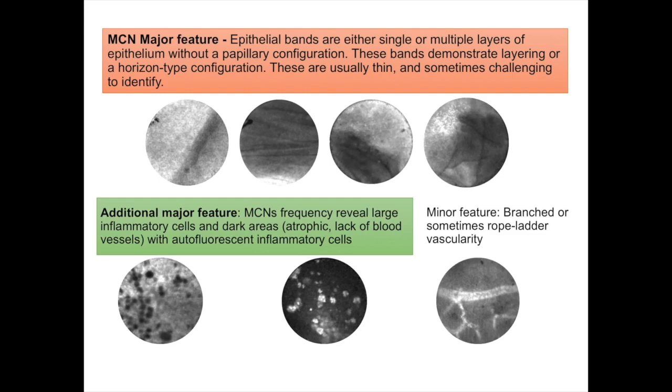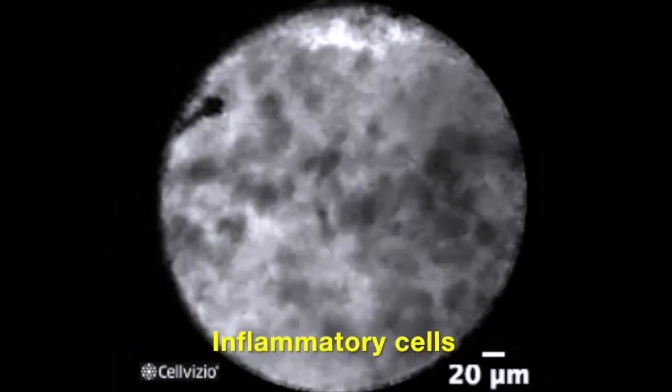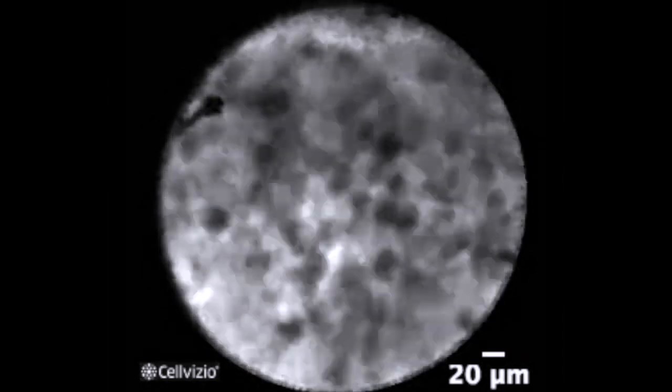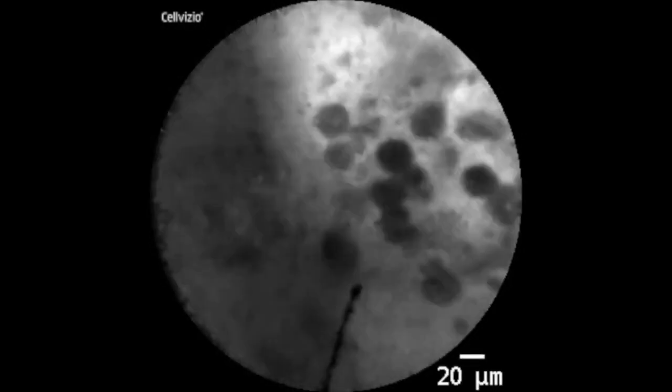Sometimes there could be a dark background suggestive of atrophic epithelium with bright shiny macrophages similar to pseudocysts. In this video you see multiple layers of thin flat epithelium. The inflammatory cells could be seen in clusters or groups. Again, another example of epithelial band in mucinous cystic neoplasm.